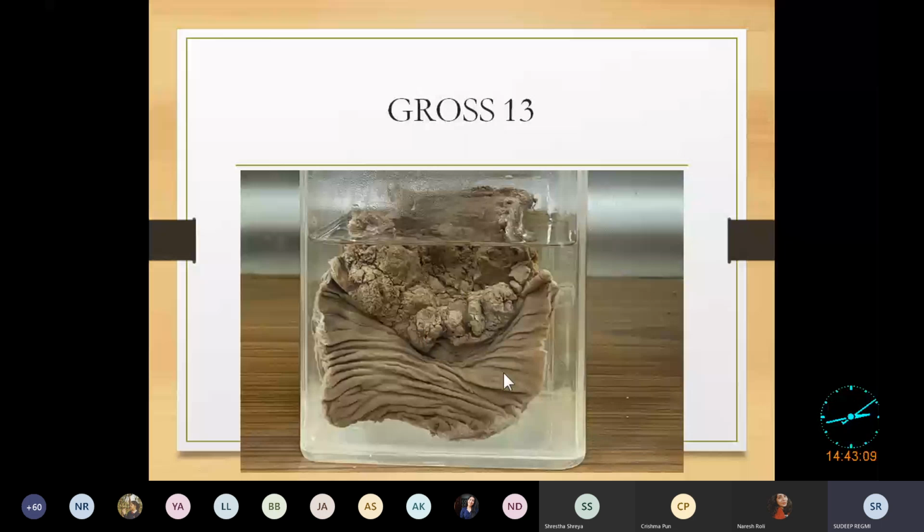So this is the ulceroproliferative mass in the part of the colon. It will be invading into the wall of the colon. I know that you know the layers of the GI tract, including colon. If this is the mucosa, then there will be submucosa, then muscularis propria, then serosa or adventitia. Variably, this tumor will be invading into the wall, and it might go out to the other structures of the body. So here we can see an ulceroproliferative mass.